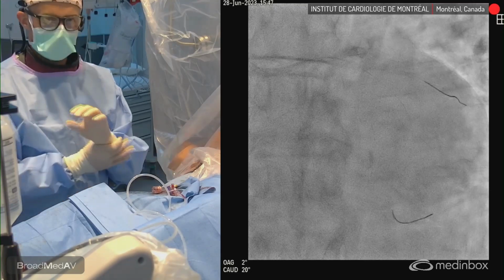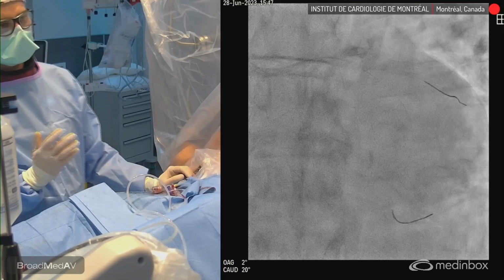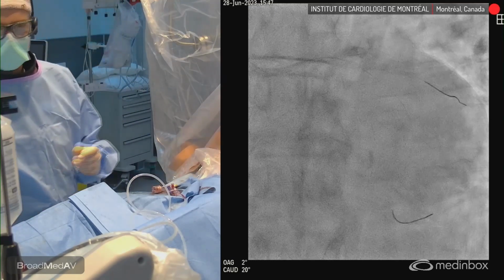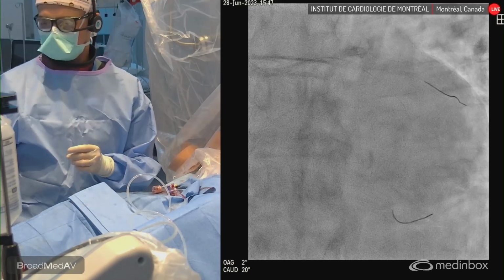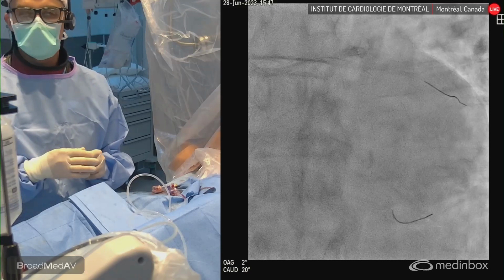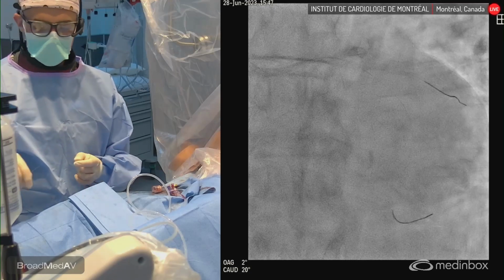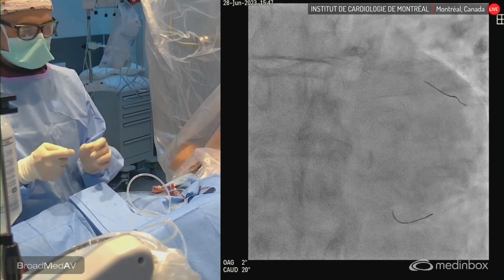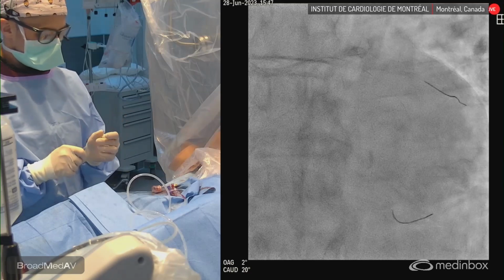Okay, I run through. Just going to protect the LAD now, and then we'll deploy the stent. And hopefully we have time for a quick post-PCI IVUS. Oh, sure, I think we'll have time. I'm going to take a second insufflator, a second inflation device, two 2.5-20 non-compliant balloons at 15, and one 5.0-15 non-compliant balloon. 5.0 and 2.5-15. There's the POT.